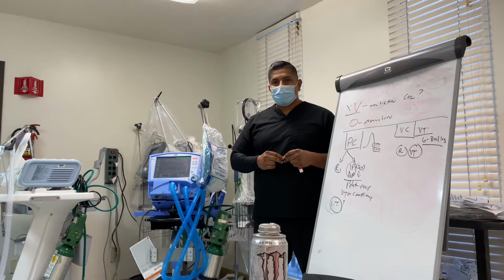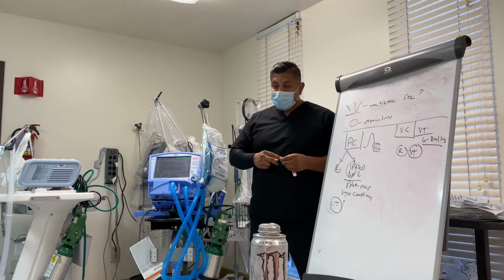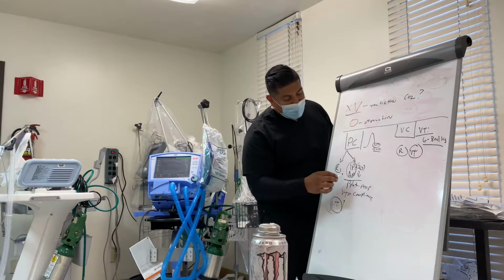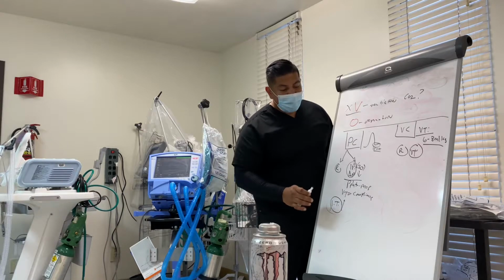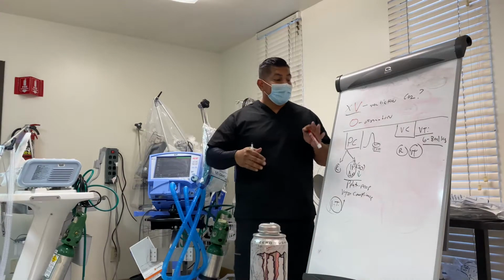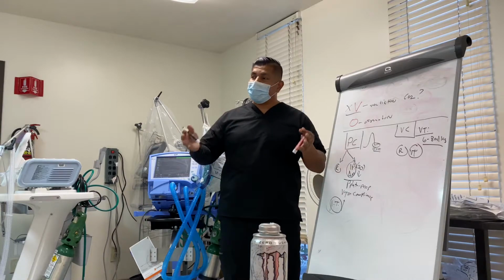Does that make sense? Mm-hmm. So if my lung compliance is crap, my tidal volume is crap, the difference is that now I'm taking more care of the lung because I am going to be aiming and distributing the pressure evenly on both sides of the lung. Mm-hmm. So if I have atelectasis on one side and nothing on the other, pressure control will take that into consideration.